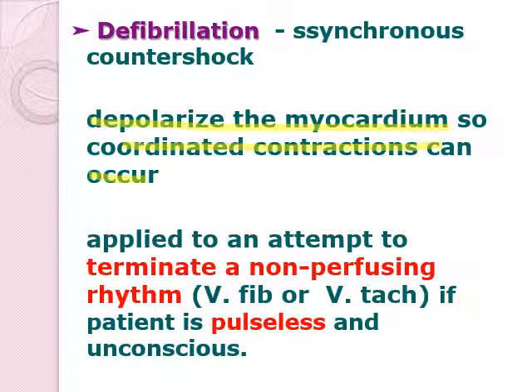Okay, defibrillation would depolarize the myocardium. Again, to compare your cardioversion and your defibrillation, in cardioversion, you need to be at sync. Okay, you need to be synchronized with the QRS complex or specifically the R wave. Whereas in defibrillation, this is an asynchronous counter shock. Okay, you can do the shock anywhere during the ECG. Then, it is applied to attempt to terminate a non-perfusing rhythm. Okay, the purpose is to terminate a non-perfusing rhythm.